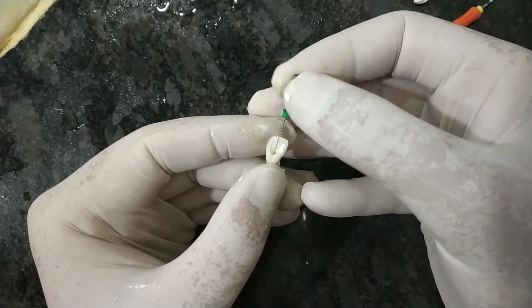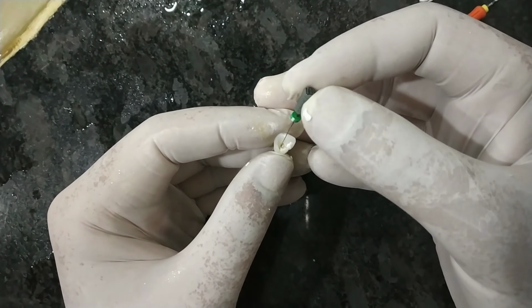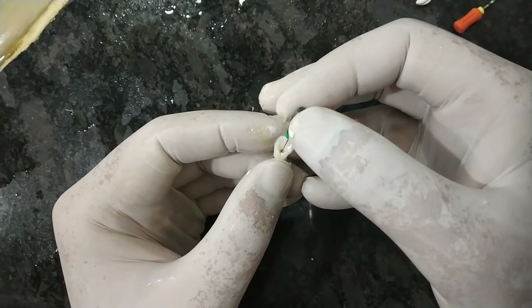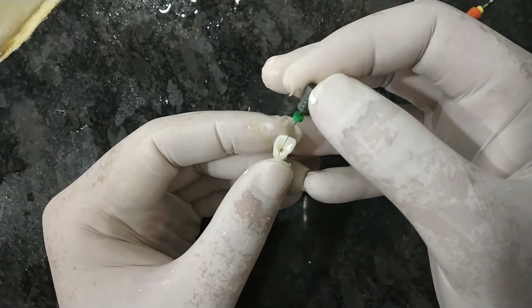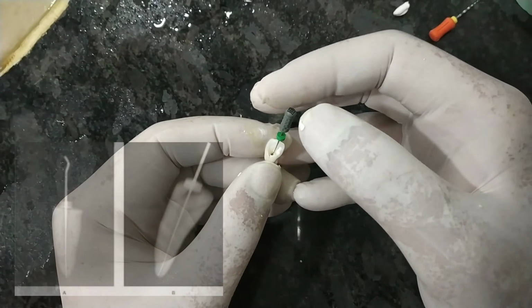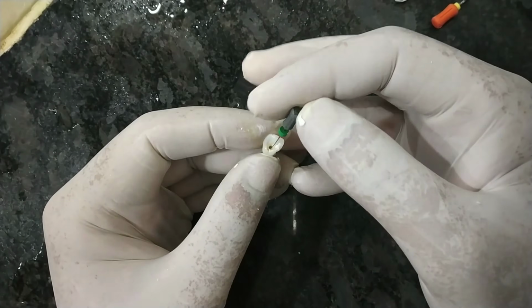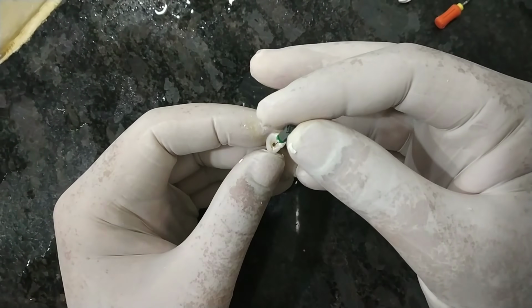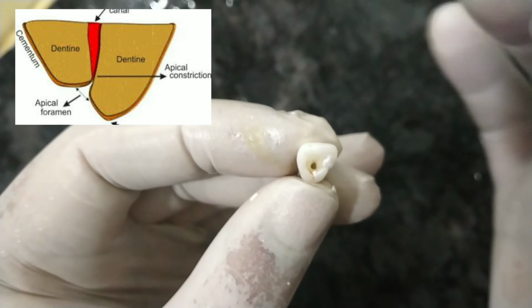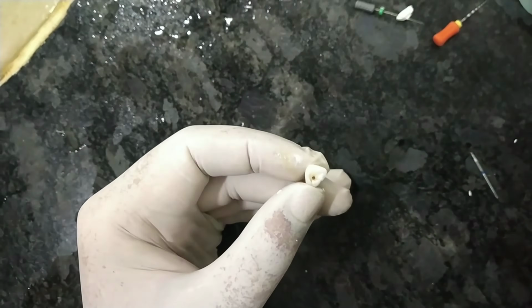What is watch winding motion? Just like this. This watch winding motion will ensure that you don't form any kind of ledge inside the root canal. Before doing all this, we have to determine the root canal length by taking the radiograph. We insert the file like this, and after that we take an IOPA of the particular tooth. Suppose the root canal length is 21 mm or 20.5 mm, then you have to note it down, and check the patency. The shape of the canal is almost ovoid, and it's very nicely done. We have to remove the dentin from the edges.